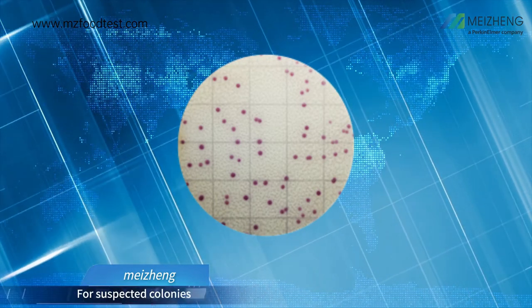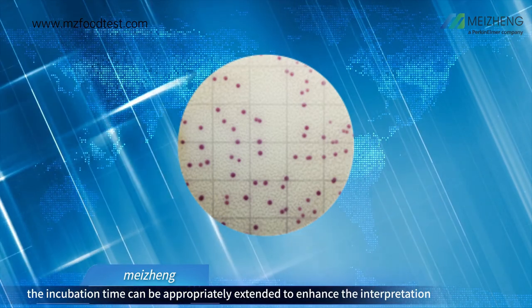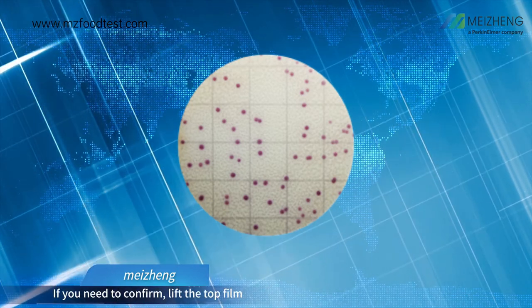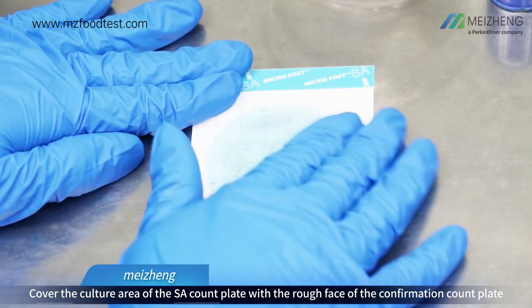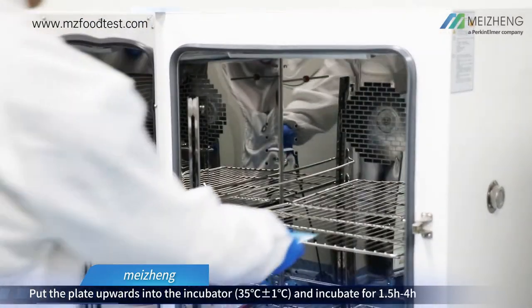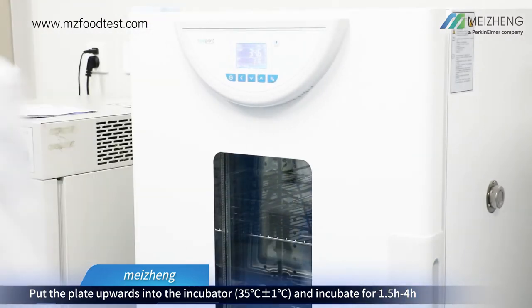For suspected colonies, the incubation time can be appropriately extended to enhance interpretation. If you need to confirm, lift the top film and cover the culture area of the SA count plate with the rough base of the confirmation count plate. Put the plate upwards into the incubator and incubate for 1.5 to 4 hours.